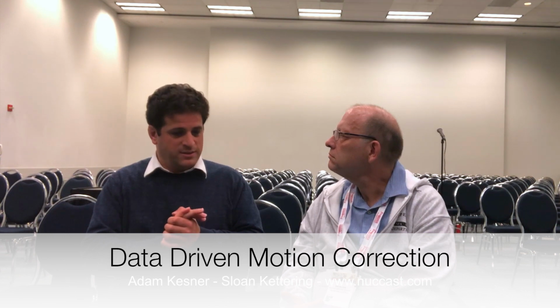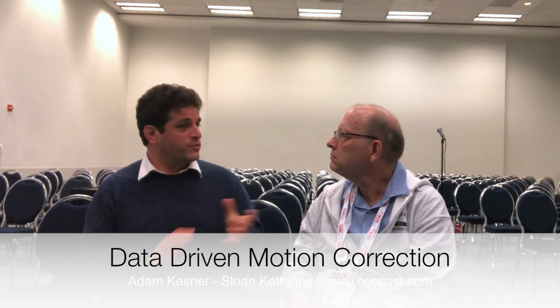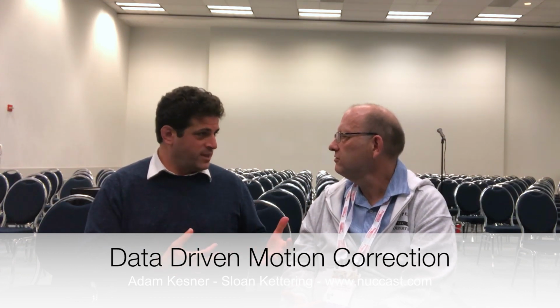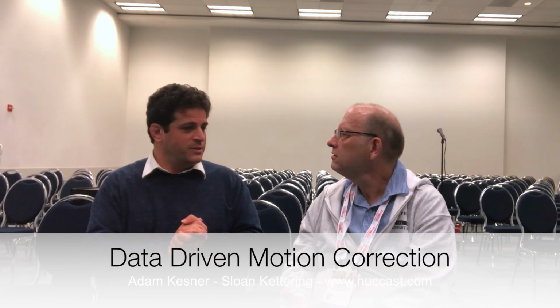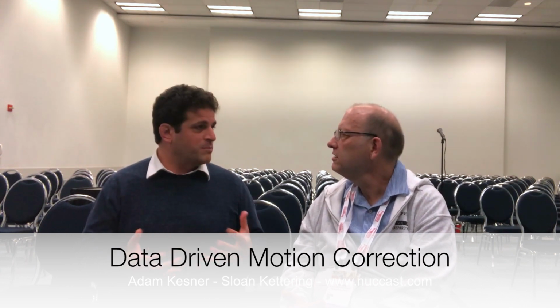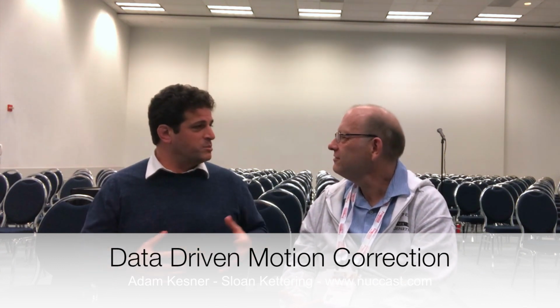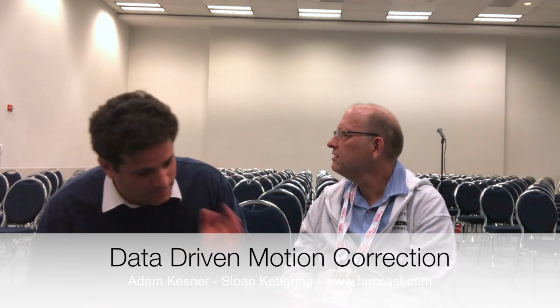The question is what we're doing good enough to make an impact? We don't need a perfect solution. So elastic algorithms, sometimes they overcorrect. This is a potential drawback of that. Optimal binning algorithms, you don't have to make any fancy assumptions. No. You only use raw data, but it's only using a subset of the data. But it makes it a bit noisier, but it's not going to produce an artifact. That's right, and it's simple to understand, it's simple to use. Yeah. So I would say each of the solutions have something going for them.